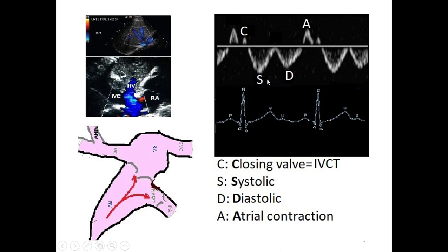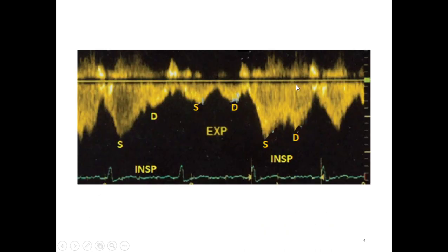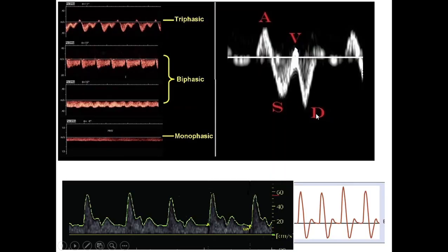Another component is the S wave, which corresponds to the systolic phase of the right ventricle. Whenever there is right ventricular dysfunction or right-sided congestive heart failure for any reason, the S wave decreases. As seen here, the S wave becomes smaller than the D wave and the A wave is more prominent, indicating right ventricular dysfunction.